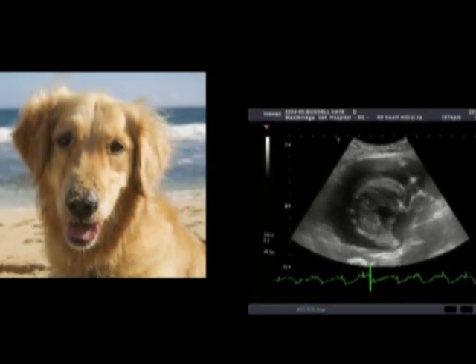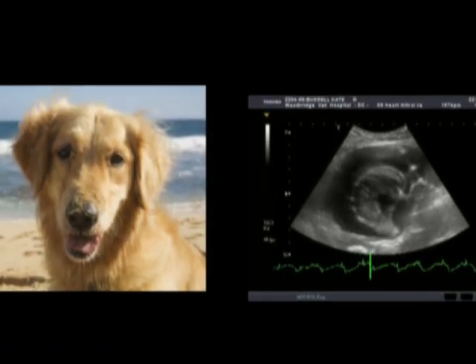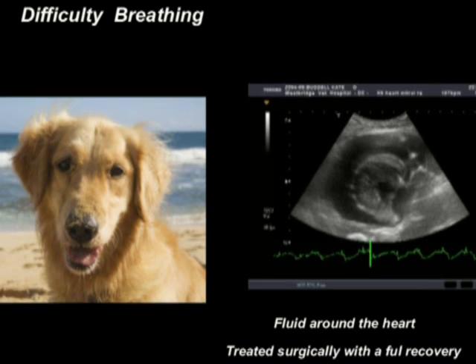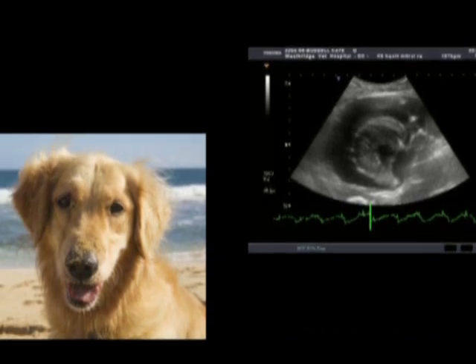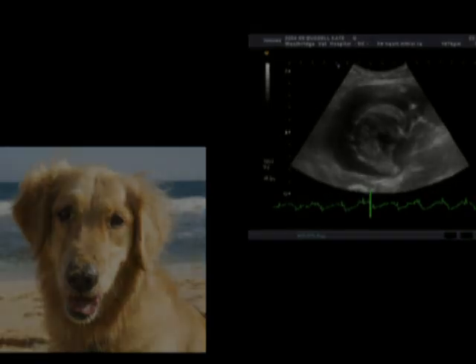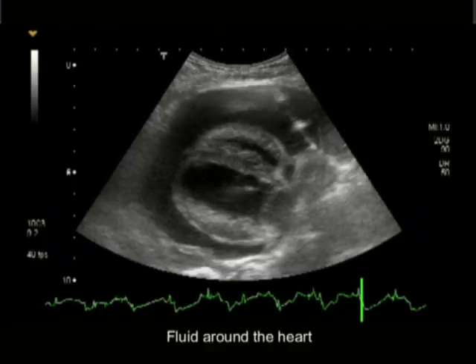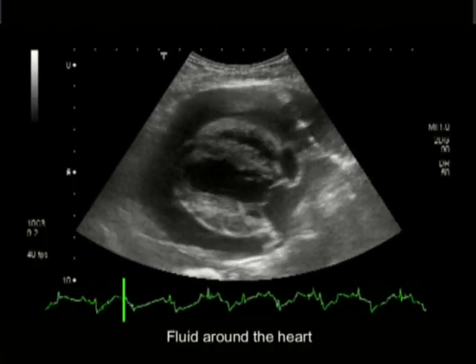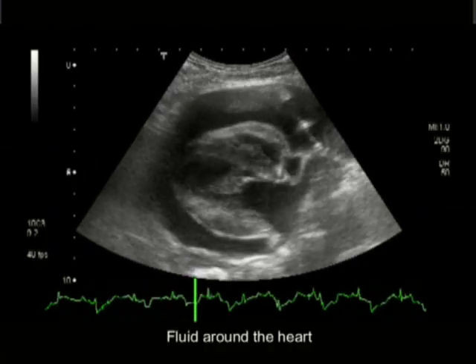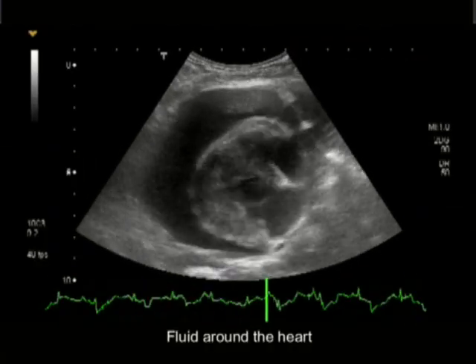This individual had difficulty breathing. On ultrasound exam of the heart, we found fluid in the pericardial sac that was crushing the heart and not allowing it to function properly.